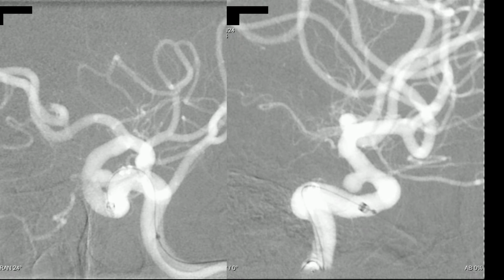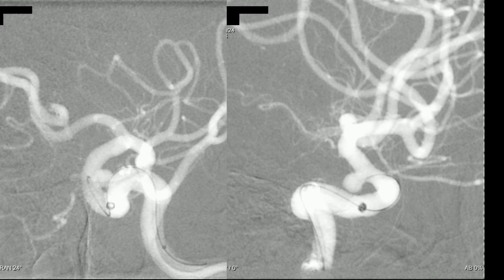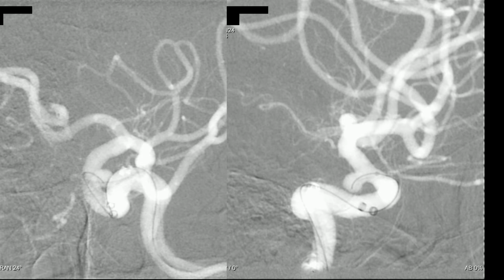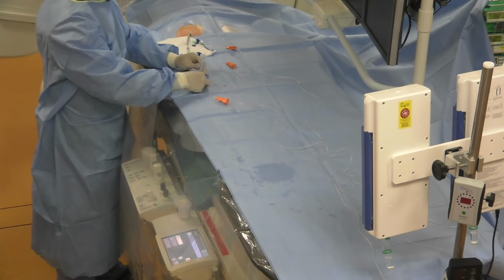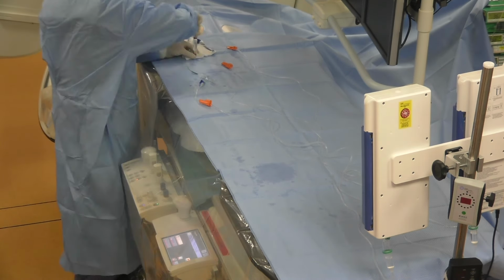And now we can push the microwire a little bit distally and navigate the aneurysm sac. And now we can push the microcatheter along the curve, and then we can enter the aneurysm with the help of the microwire. And now the tip of the microcatheter is in the aneurysm sac. We perform by standard a 2D angiogram after navigating the aneurysm sac to make sure that we have not caused any damage to the aneurysm wall.